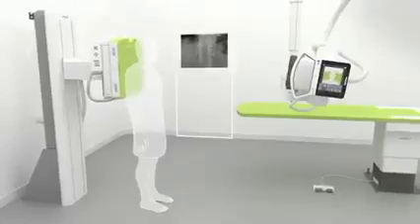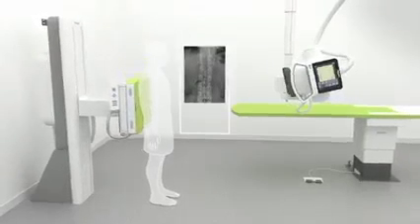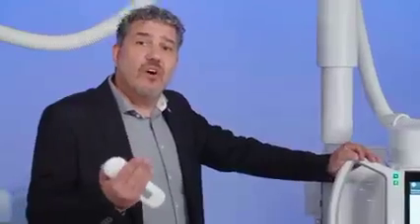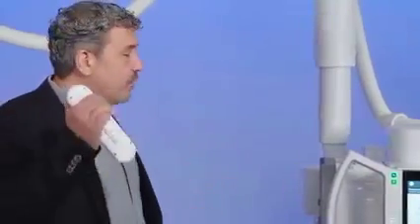It has been proven that because of this, patients are more at ease. They know what's going to happen, and you have a better success rate while creating those 2 or 3 exposures. So you just saw how stitching is being done on the C90. And of course, the 3 images created will be automatically reconstructed into one nice overview of the spine or the legs. But there's much more what the C90, especially in combination with this movable wall stand, can do. For example, take the cross-table lateral exposures.